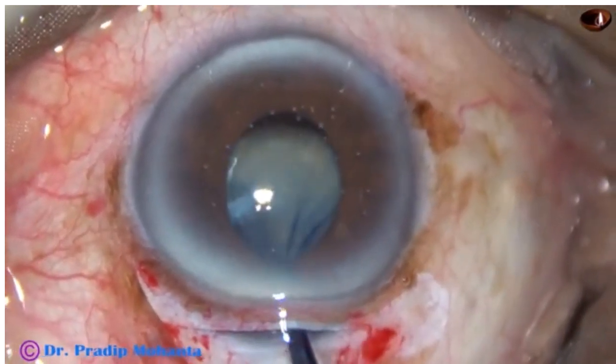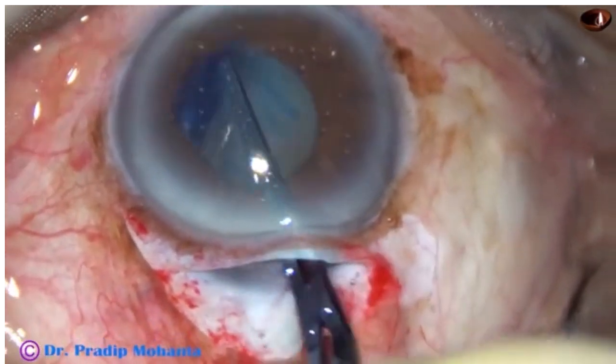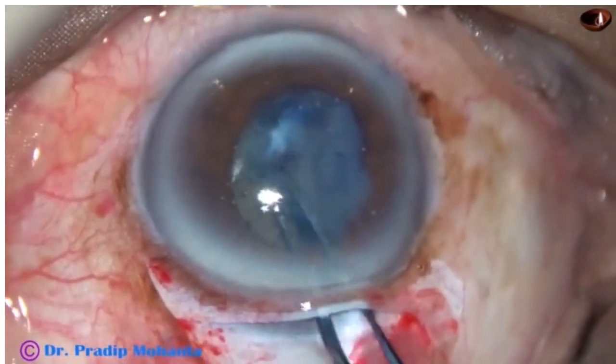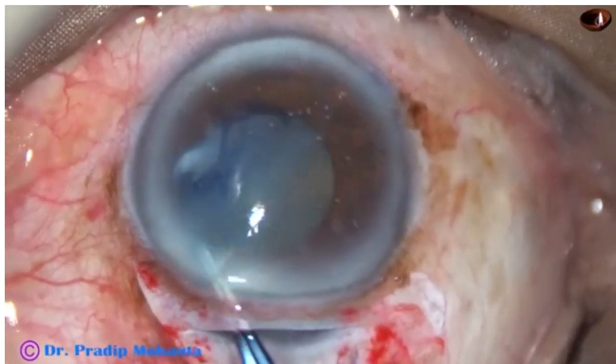That's the forceps. It's introduced into the AC. The capsule is held, and you see the surgeon is basically detaching it from the 360-degree zonular support. It's like breaking the zonules, right? With this to and fro motion.